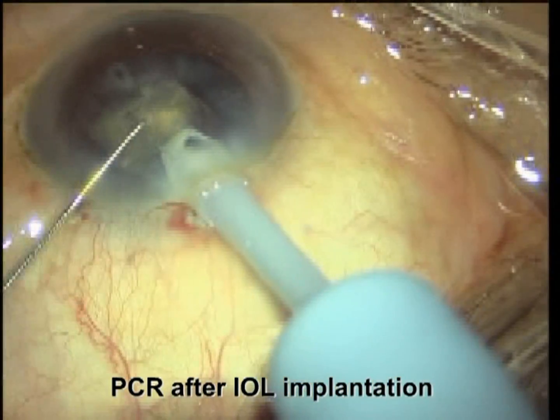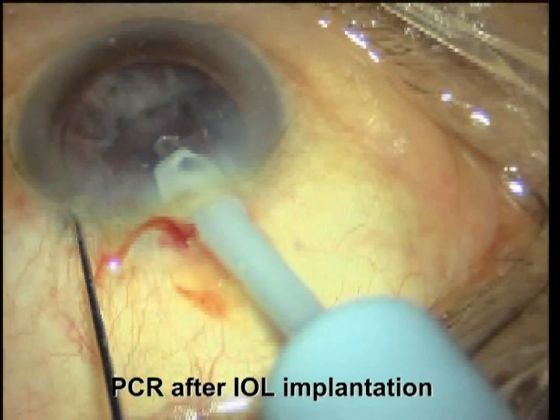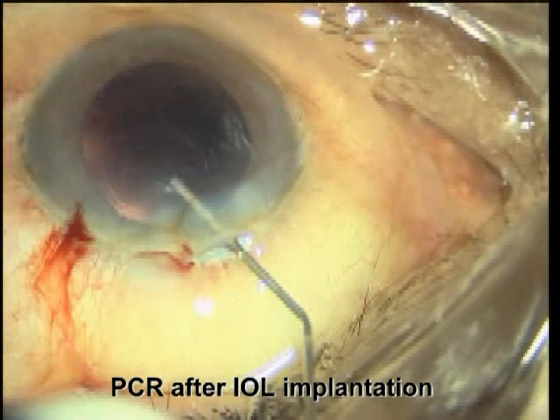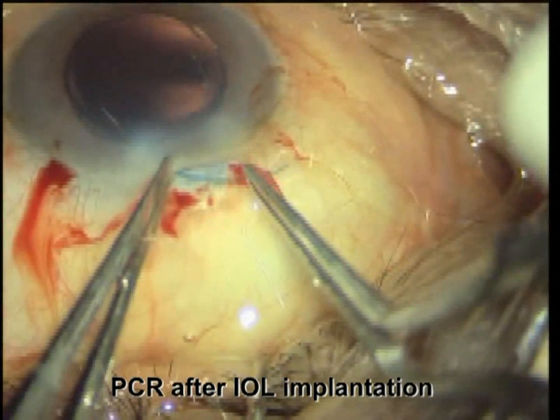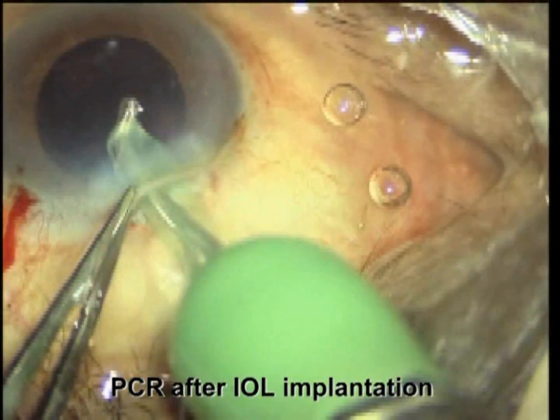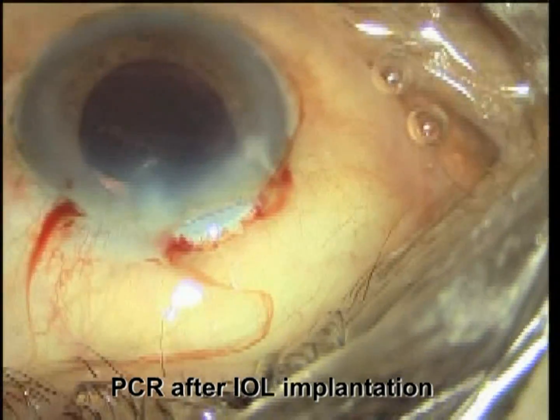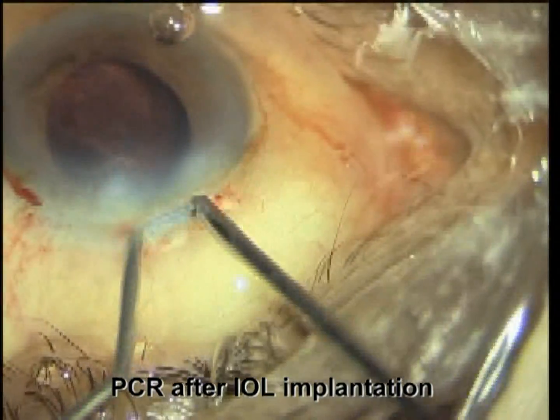In this case the posterior capsule rent occurred after intraocular lens implantation. After cortical wash the posterior capsule was intact and the intraocular lens was implanted in the bag. However, when the viscoelastic substance was being washed off, PCR was seen in the superior part. In this case one has to perform a localized anterior vitrectomy.